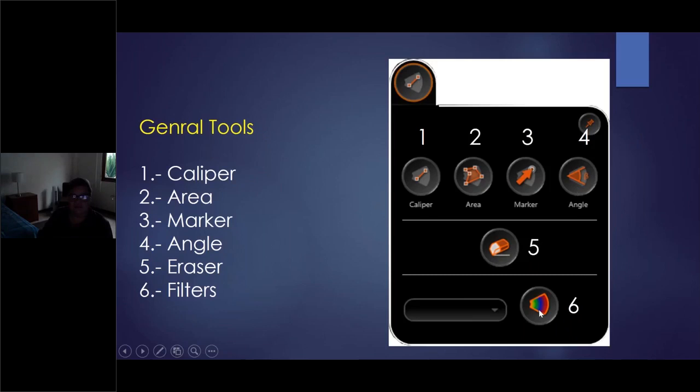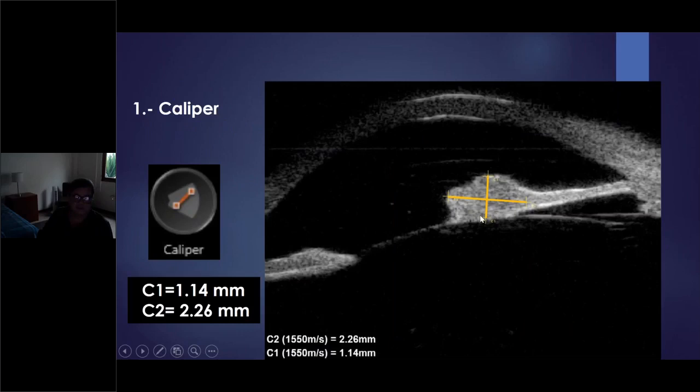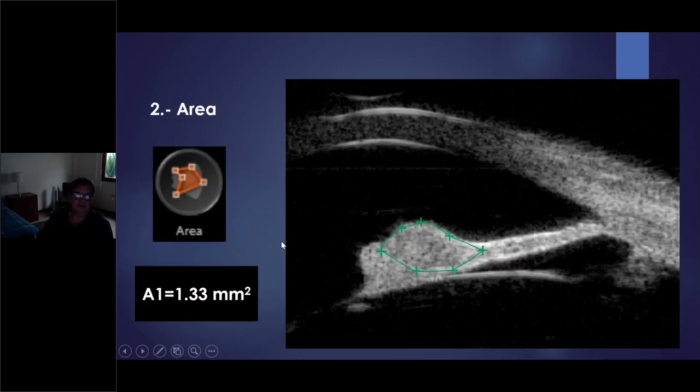For example, you have a tumor in the iris. We use the caliper number 1. I can make C1 and C2, and I have one diameter and the other diameter as easy as possible. Then, if I want to look at the area of the tumor, I can make this, and I have 1.33 square millimeters in this case. I know this dimension of the tumor.